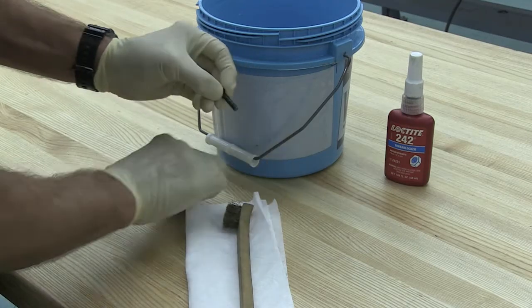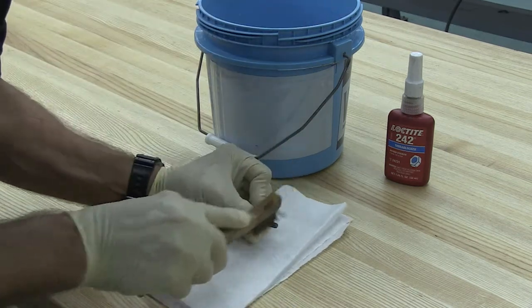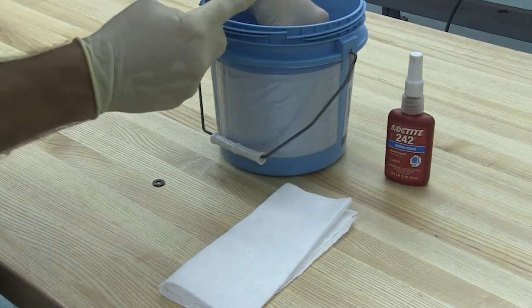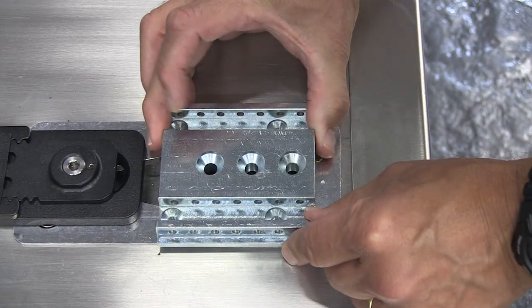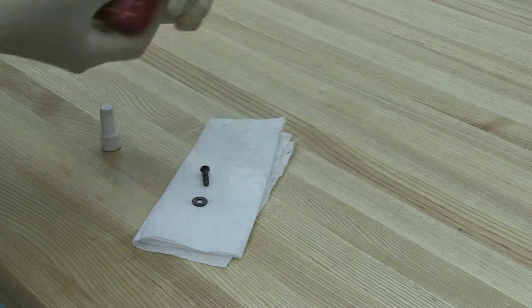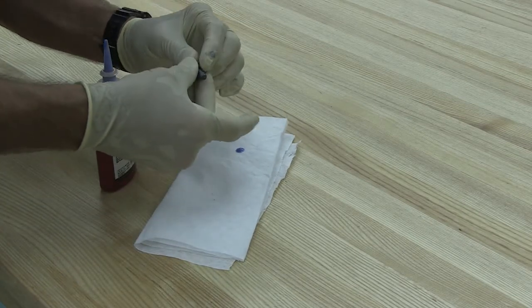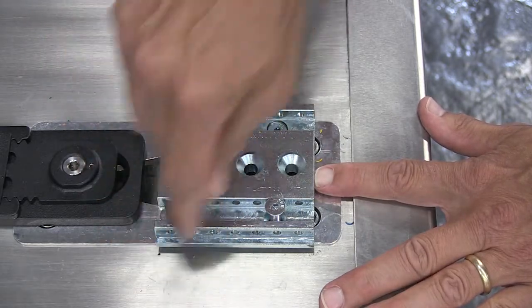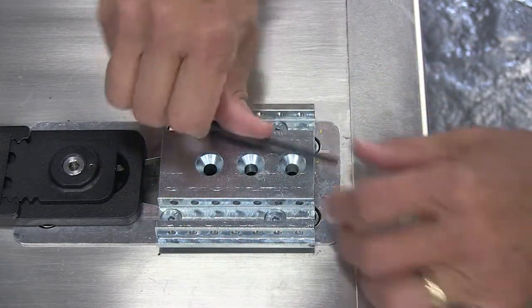Prepare the 4 ¼ inch flathead screws that are provided and the receiving threads in the safety hook mounting block by cleaning the threads of the screws plus the mating threads of the safety hook mounting block with acetone or an appropriate Loctite cleaner primer, which is not supplied. Allow the threads to dry completely. Orient the safety hook mounting block with the three center holes toward the rear of the vehicle. Apply one drop of thread locker, such as Blue Loctite 242, to the threads of the screws. Install the screws immediately and wipe off any excess thread locker. Use a 4 mm or 5/32 inch imperial Allen wrench to install the 4 ¼ inch flathead screws through the safety hook mounting block and into the floor mounting block. Let the thread locker cure for a minimum of one hour before using the system.